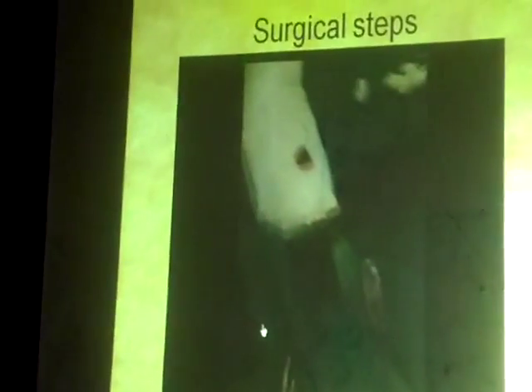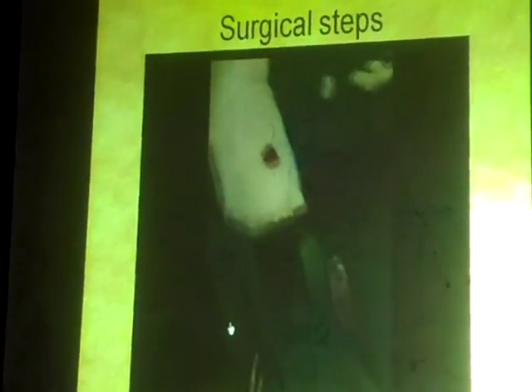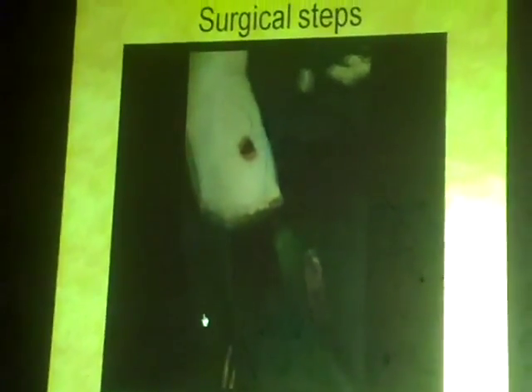And classically, this step should be done with your right hand, if you're right-handed, while your left hand is put over the shaft of the adenoid curette, so it can work as a fulcrum, so that you can stabilize your adenoid curette while you are curetting. This is why in the instruments we have found a place, a depression, where you can put your thumb, so that your thumb will work as a fulcrum. Okay? You may need 2 or 3 sweeping motions before you can remove the adenoid completely.